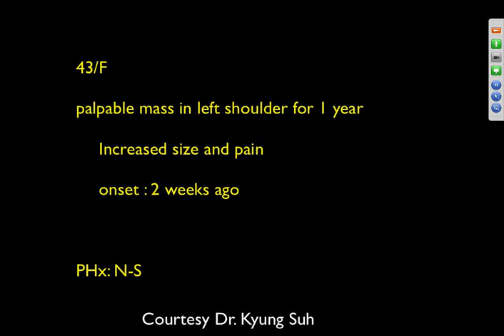It's a benign lesion. That's why it's been there for so long, and it's just another type of benign vascular tumor. Can have very different appearances on an MR examination.